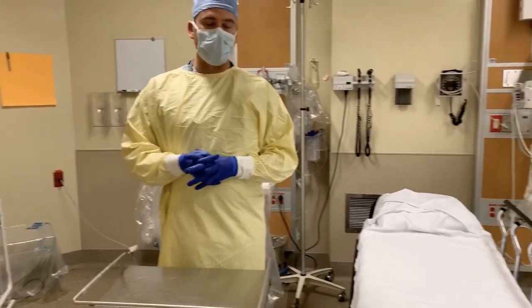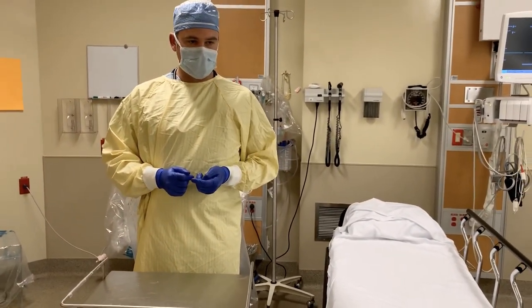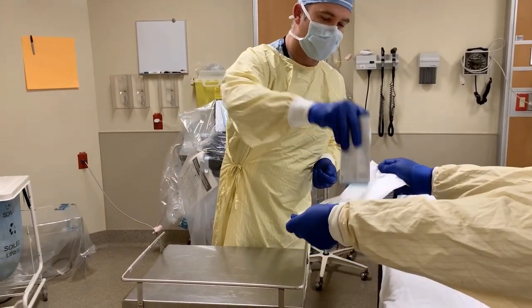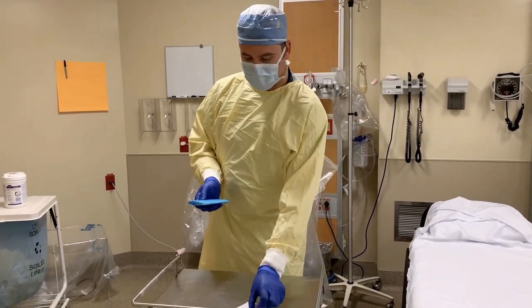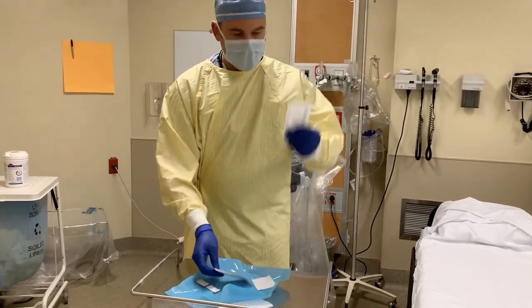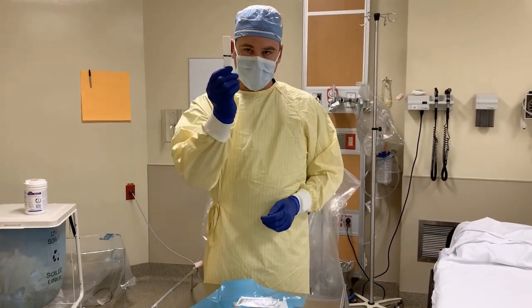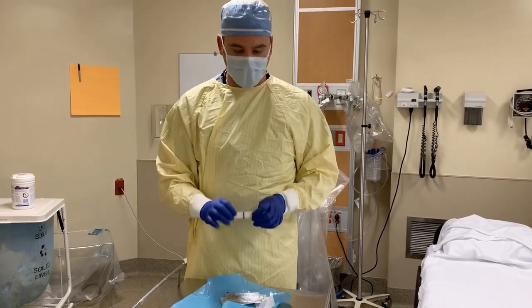I would ask my nursing colleague to hand me the sterile probe and gel to cover the ultrasound machine. So again, we're working on the premise that this is a sterile field. In our kits — in our bags — we have a sterile cover in plastic, sterile gel in its own package, and two small rubber bands with some adhesive if required.